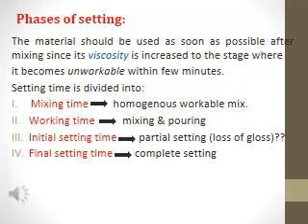So at which point can you separate the model from the impression? It takes 30 minutes. After half an hour you can separate the model from the impression without risk of affecting the model or breaking it. Its compressive strength is sufficient, about 80% of its total strength, so you can remove it at ease after half an hour.